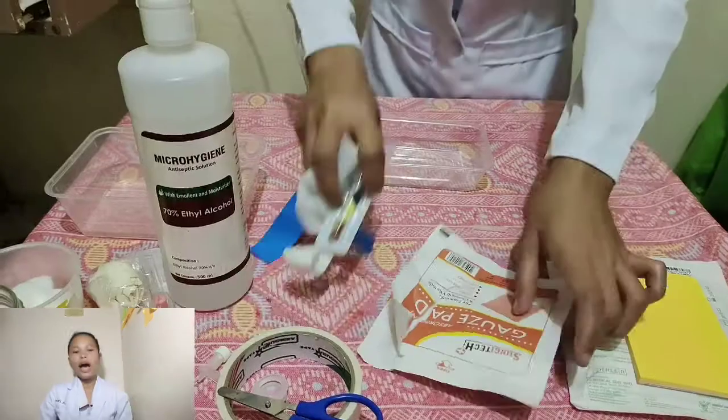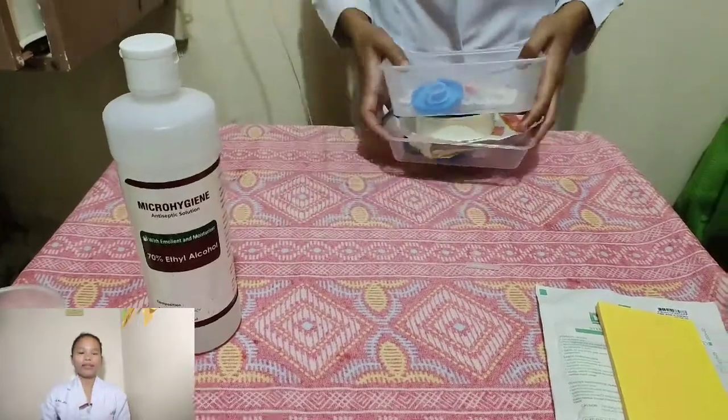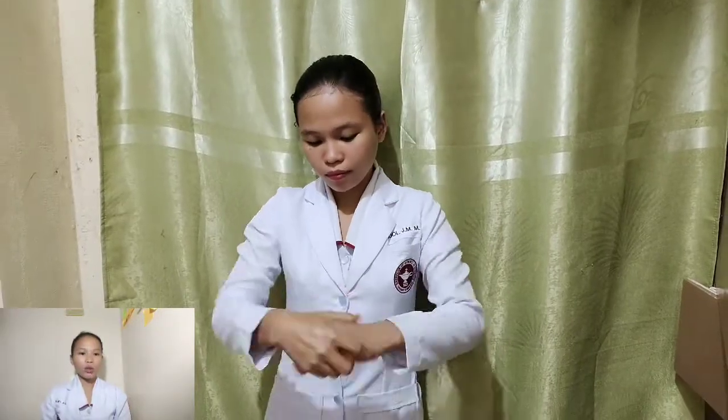Take care of the equipment and wash your hands to deter the spread of microorganisms. Document the procedure and the client's response. Chart the time, site, device, solution used, and rate of flow, and the physician or nurse who inserted the needle. This provides accurate documentation and ensures continuity.